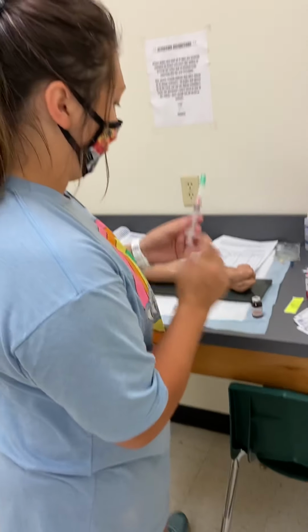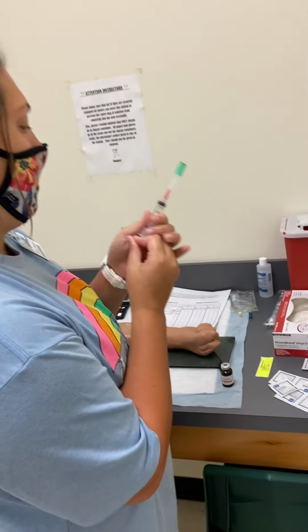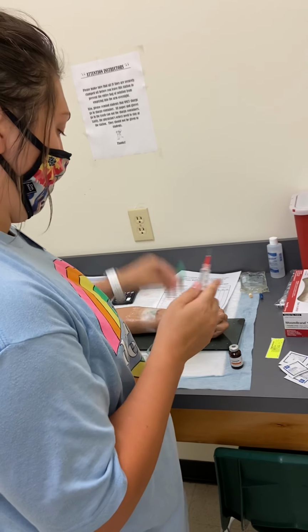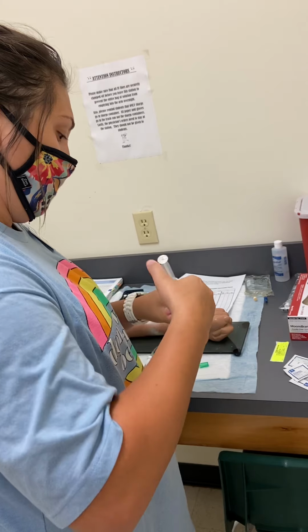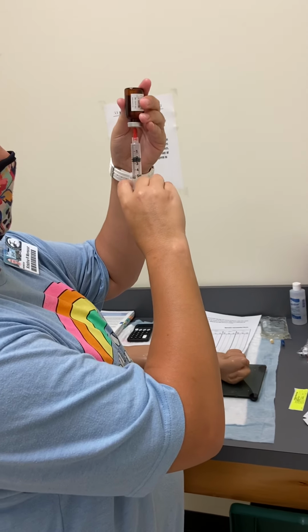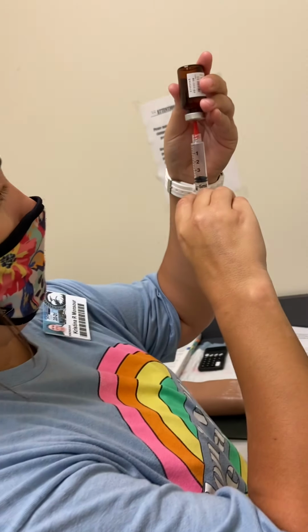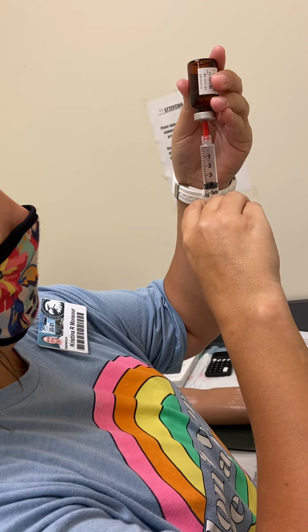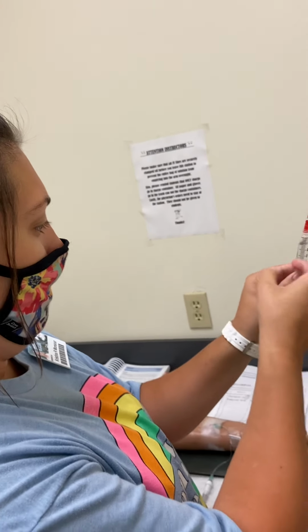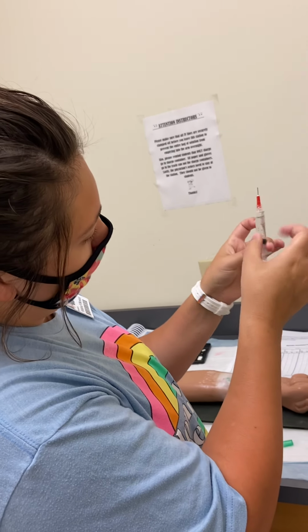Alright, I'm giving 4 ml, so I'm gonna draw up. Check it for air bubbles.